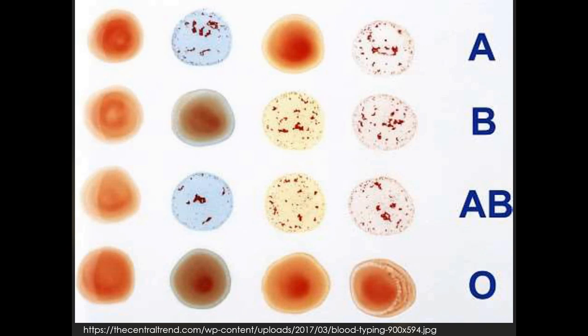I've told you the top one is A. Looking at the rest of the results, even if I didn't label them, what column is my control? Yes, the leftmost column. So what does that tell me about what kind of A that should be? It's A positive because there are two columns that are reactive. One of them is an antigen and one of them is the Rh factor.